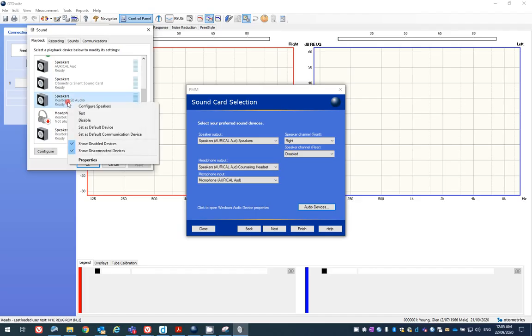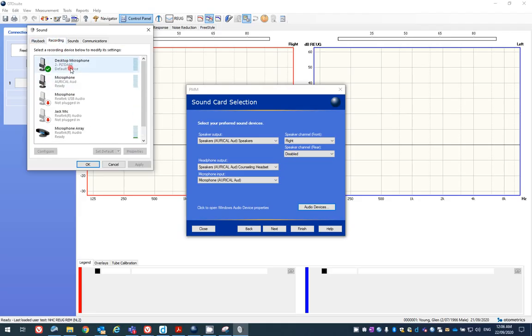So if we right-click, we can set that as the default device. And if we right-click again, we can set it as the default communication device. My default communication device is okay, so I'm not going to select that one, but in the clinic, that's what you should select. So if we check also on the recording, you'll probably find that you've got the Aurical microphone set as a default as well. So same thing, find your Realtek device, right-click, set as default, right-click again, set as default communication device.